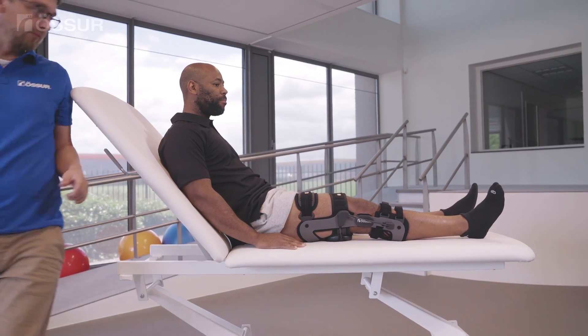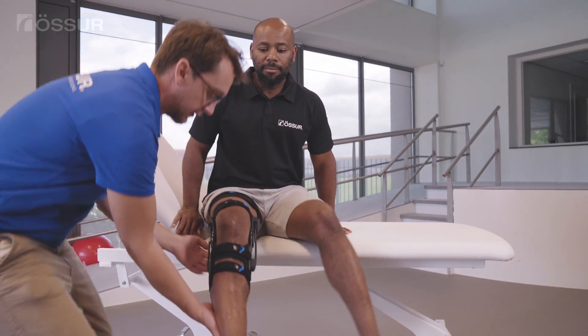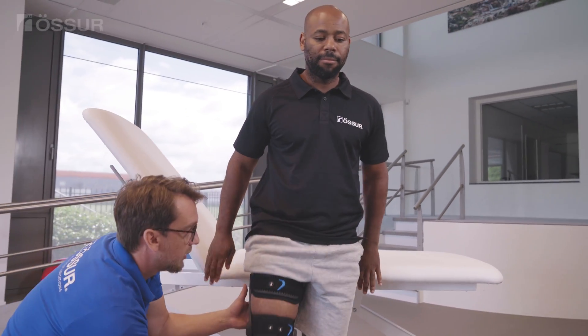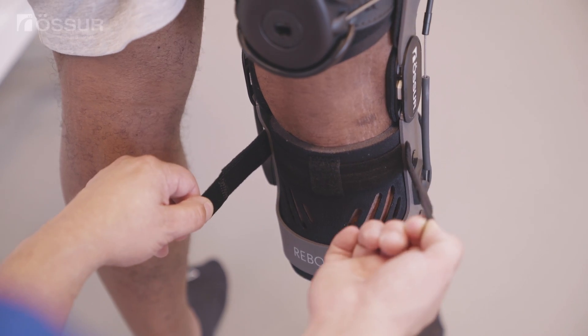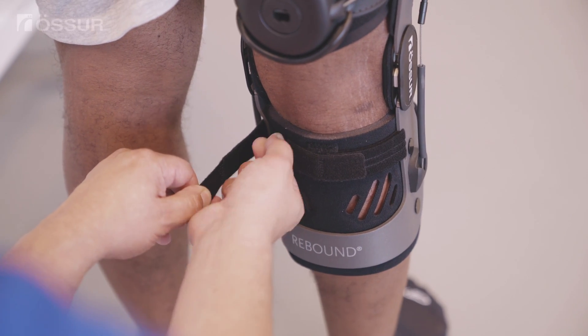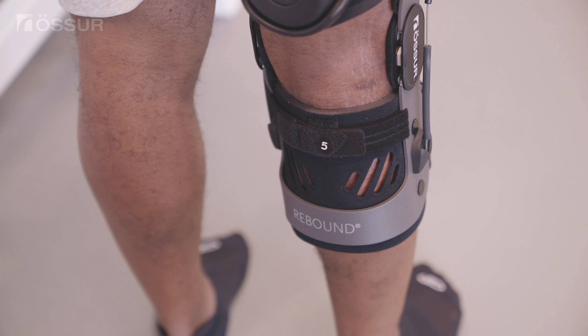Ask the user to stand up. Adjust the posterior calf strap to affix the hinge in its centered position at the midline. If the brace is too anterior, loosen the upper shin strap and tighten the calf. If the frame is too posterior, loosen the calf and tighten the upper shin strap.